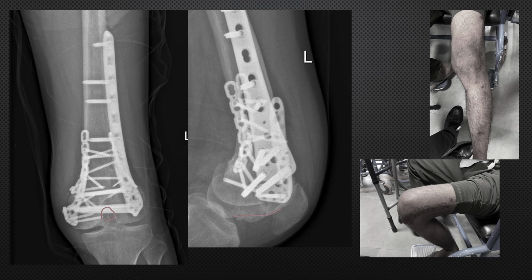Now the problem the patient had is the implant prominence. So too much hardware is definitely a problem, but the stability should not be compromised. So the patient had complaints of impingement on the lateral side. You see the plate on the lateral side is a large profile plate, so that is definitely going to cause impingement in some patients, especially lean patients.